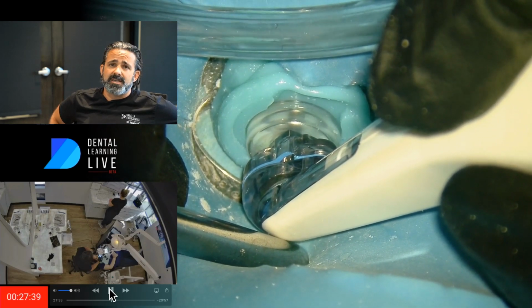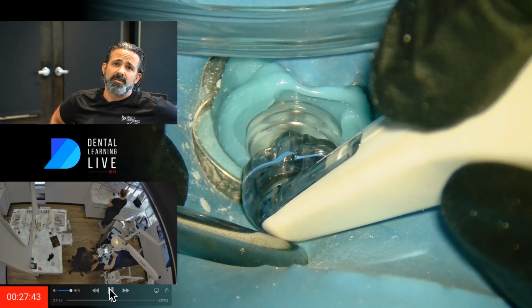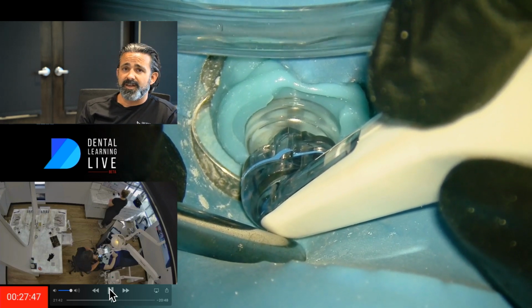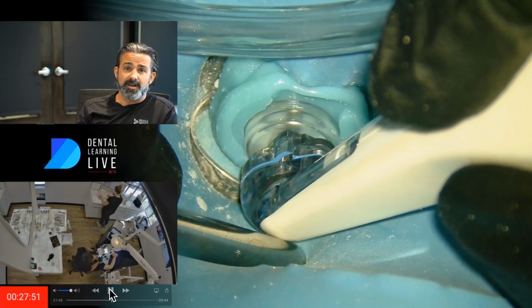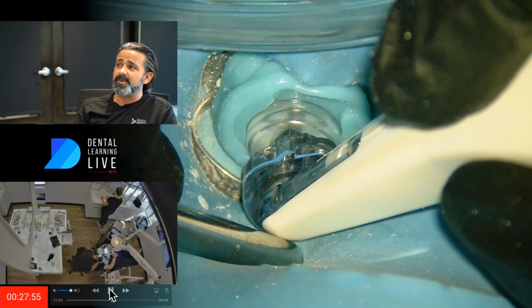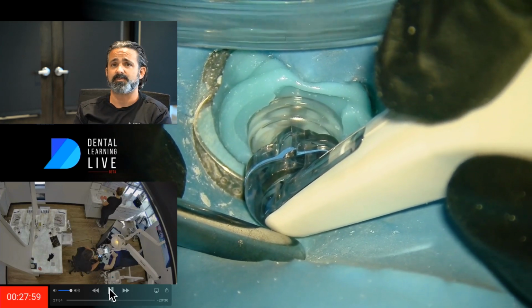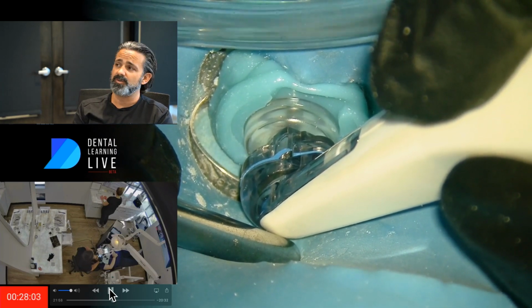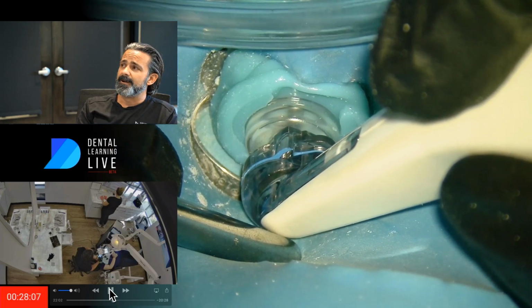There's a lot of talk on instrumentation lengths with the procedure, about maybe keeping it a little bit shorter than your defined terminus, going back a millimeter. But in retreatments, this gets to be a great topic, because where are you going to define it? You're going to define it where the last practitioner was. And then you want to make sure you can employ the GentleWave, which is what we did here.